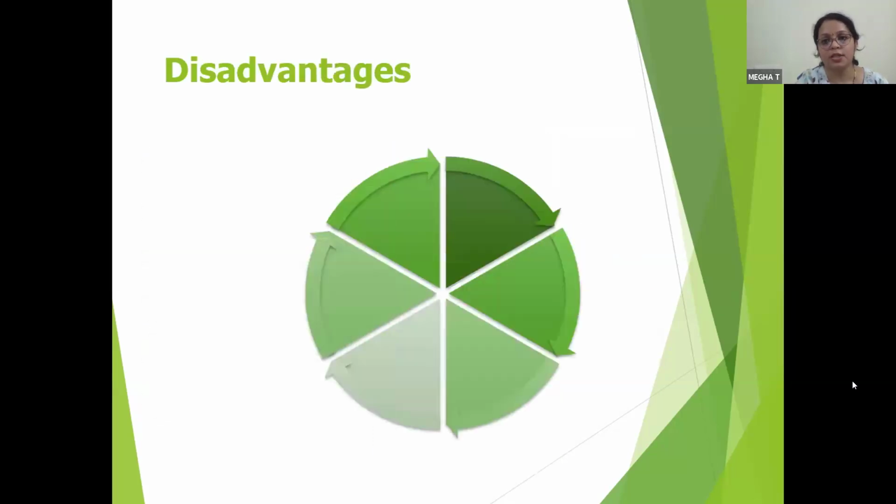So disadvantages, as we know, more attention is required. The anesthetist has to be aware, alert, watch for a hypoxic mixture, keep an eye on the flow meter and the dial concentration, so that he does not deliver a hypoxic mixture, nor deliver too little volatile anesthetic, causing awareness.